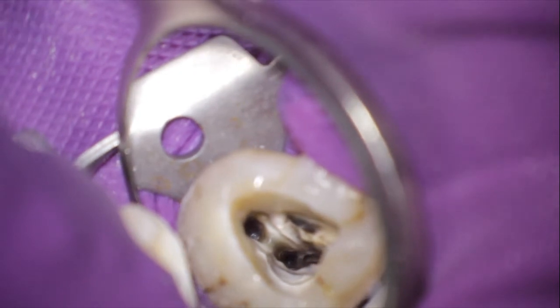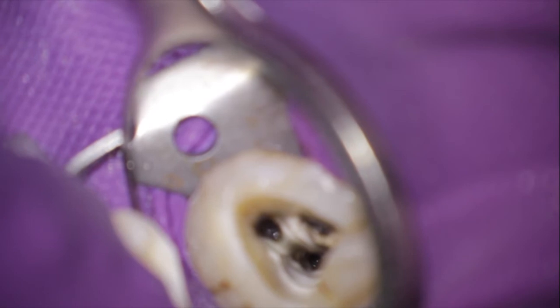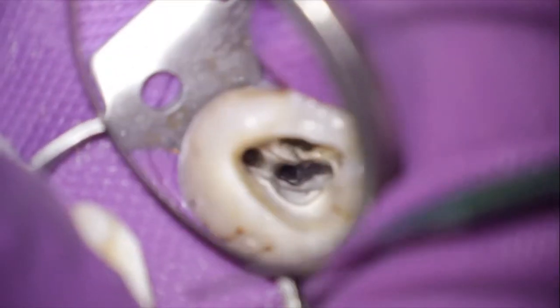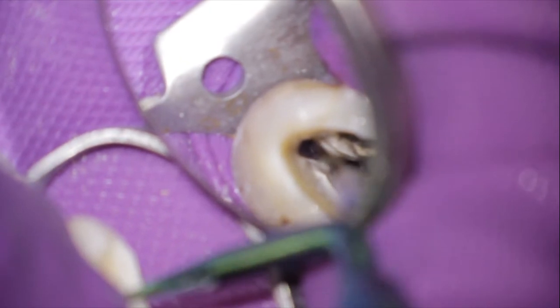Here you can see the fragment which was located in the curvature to the buccal canal. With uncounted ultrasonic tips I tried to vibrate the already loose fragment out of the canal. I thought it would jump out quickly, but it didn't. Also I tried to give it a push from the buccal canal, but the only thing it did was move around a little.